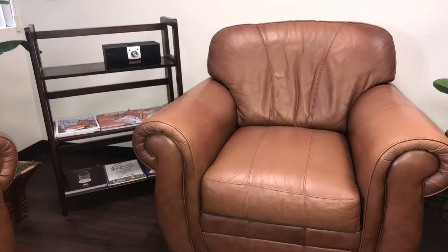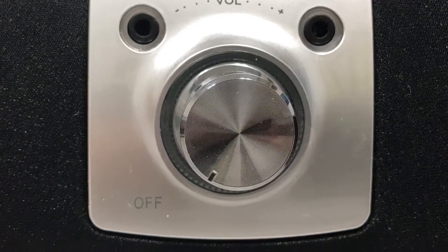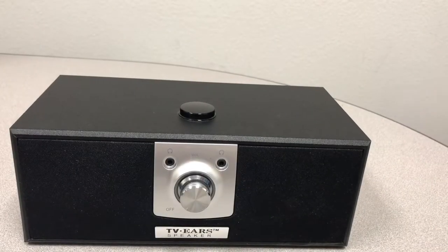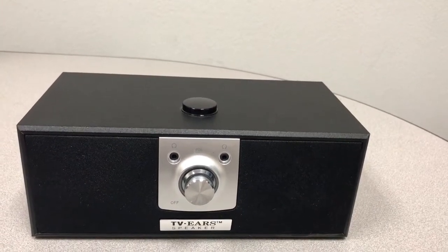Place the TVEUR speaker within an arm's length of where you sit down to watch television so you can easily reach the volume dial on the front. For the best audio reception, make sure the circular disc on top of the speaker, also known as the receiver, is exposed and out in the open.